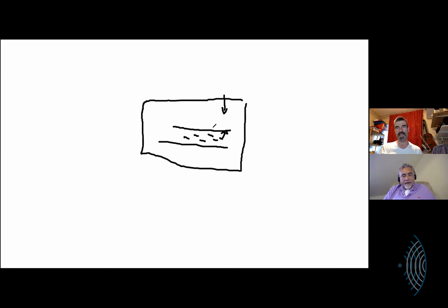Because the power Doppler doesn't worry about the direction, it is thought, or people believe, that it then allows you to display more of the information more sensitively. And in theory, that is true. In practice, I find that the reverse is true.